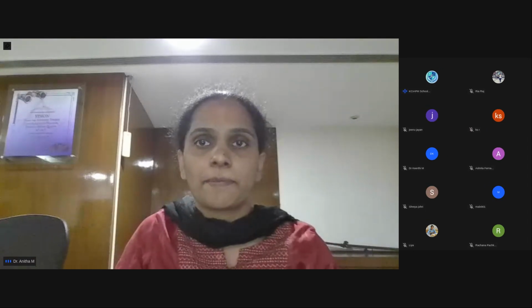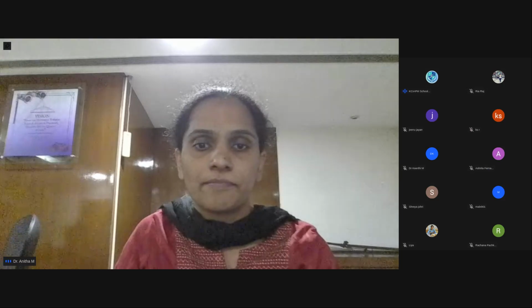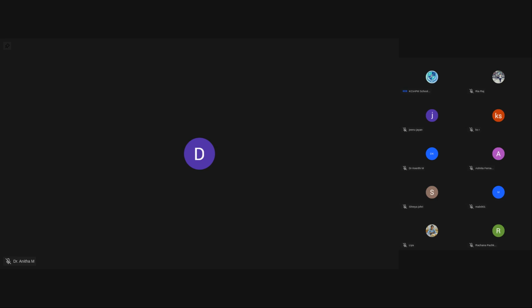Thank you, ma'am. As we discussed earlier, we will now... Do you want to share? Do you have a spotter now? No spotter. We can go to the next case. D1. Yes, D1, right? Okay, so we will take the hematology cases at the end, and we will go ahead with D1.